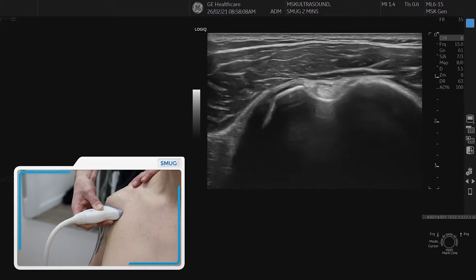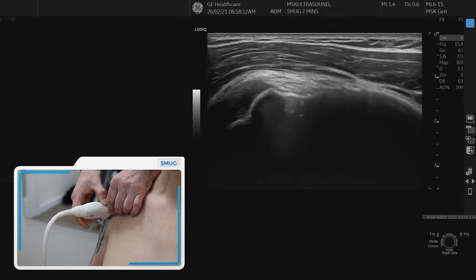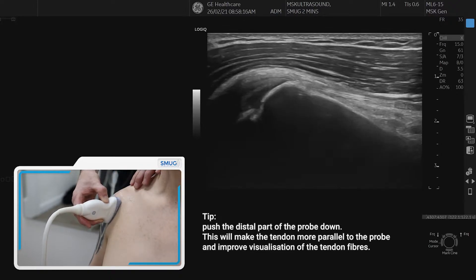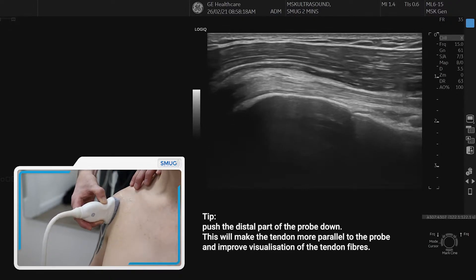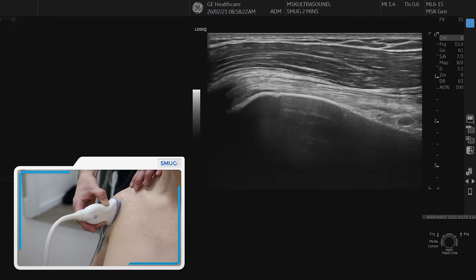It's a good place to spin, so if you do it slowly, keep the tendon in the middle and you can slowly spin it until you see the longitudinal fibers of the biceps coming in. Make sure the distal part of your probe gets pushed in so the tendon gets nicely lined up with the surface so you get a nice, bright fibrillar pattern of the biceps.